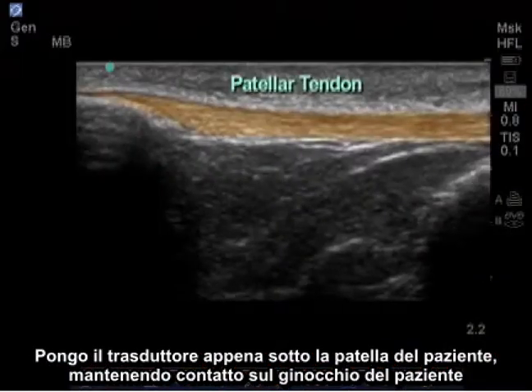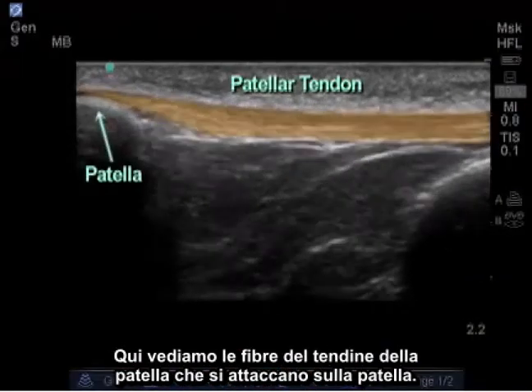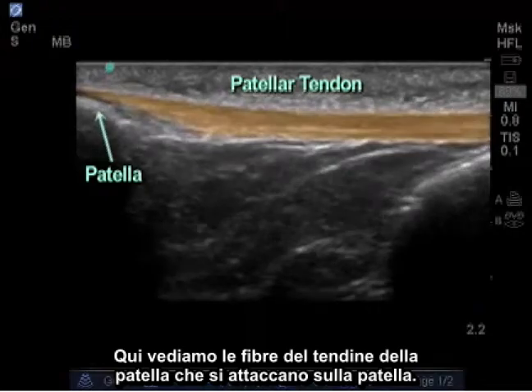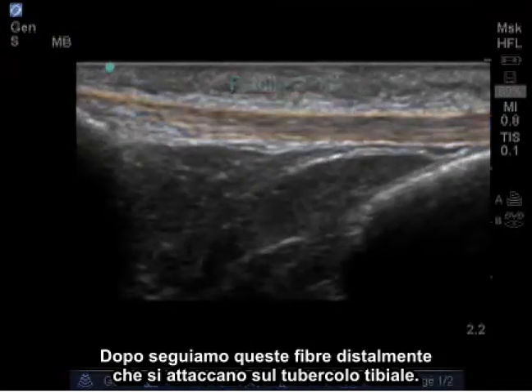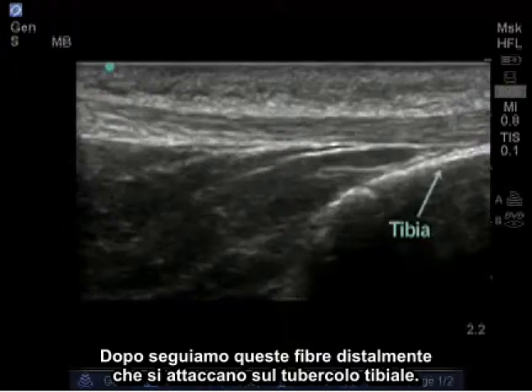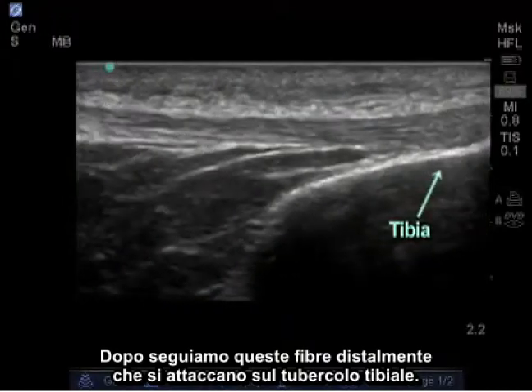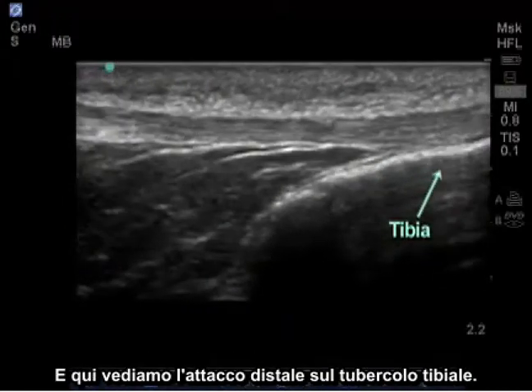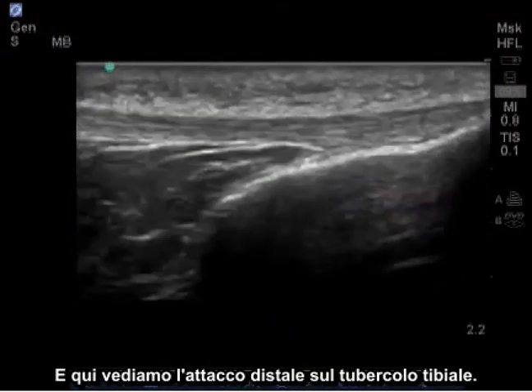Here we see the fibers of the patella tendon attaching on the patella. Next, we're going to follow these fibers distally as they attach on the tibial tubercle. And here we see the distal attachment on the tibial tubercle.